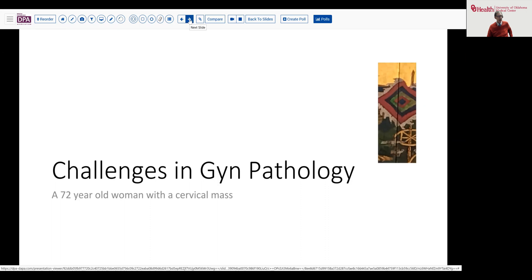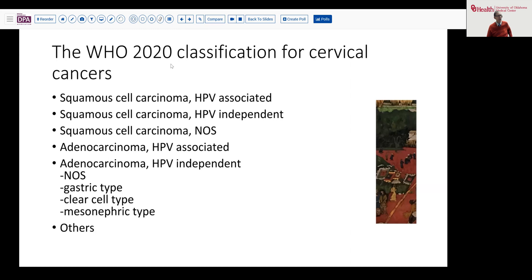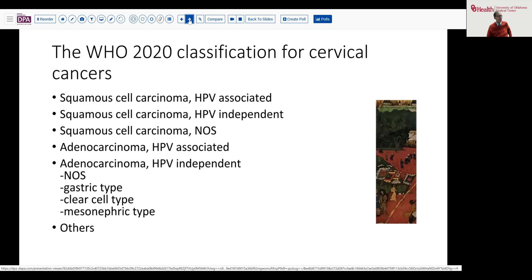The reason I'm bringing this case up is not because it's a diagnostic challenge, but because there's an area of development that I think is important for you to know about. In 2020, the classification for cervical cancers was modified, particularly for adeno and squamous carcinomas, to differentiate between HPV-associated and HPV-independent carcinomas. We preserve a category where we can't classify the type, and we know some adenocarcinoma subtypes fall in the HPV-independent category. This underscores the need to consider appropriate age groups and classification for each carcinoma biopsy.